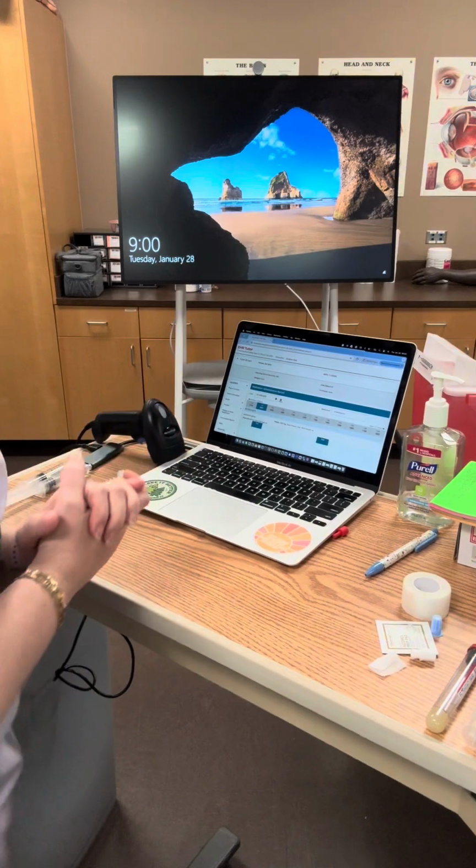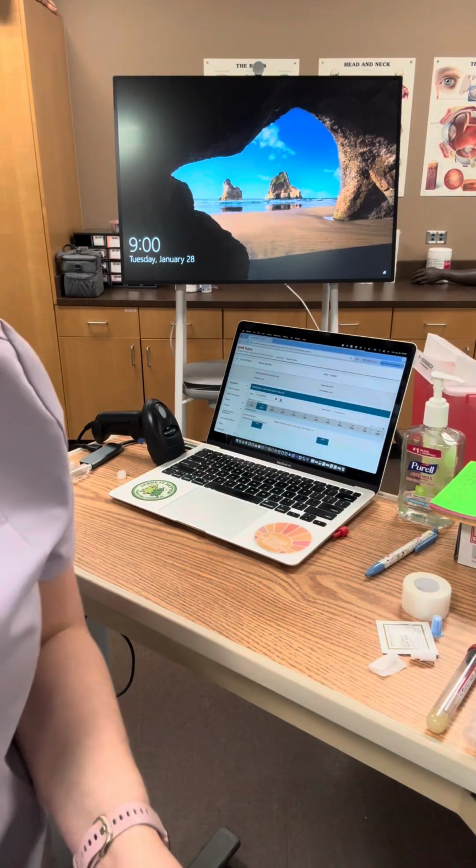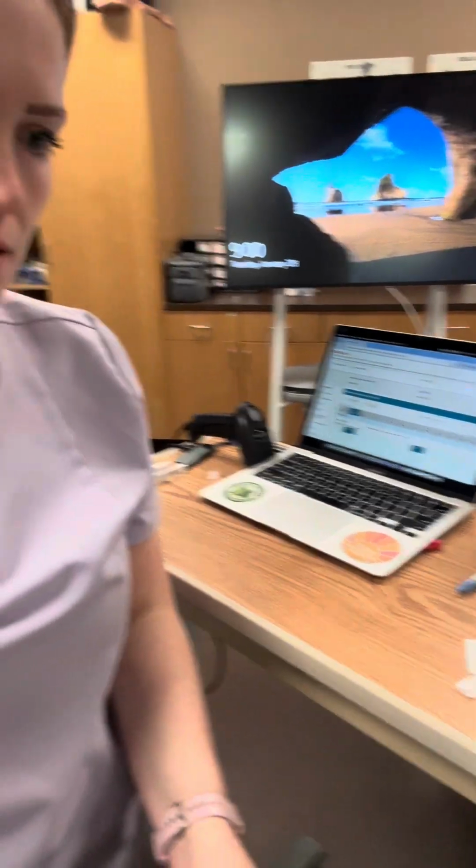This should be good. All right, Ms. Brown, I'm going to go ahead and lower your bed to a nice working position. And if you need anything at all, please let me know. I'm going to perform hand hygiene before I come back shortly for you.